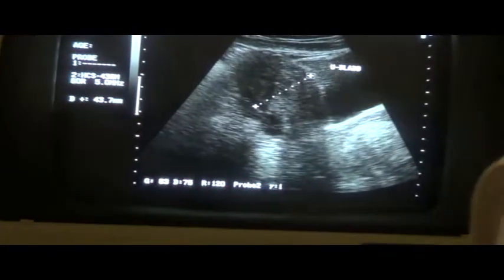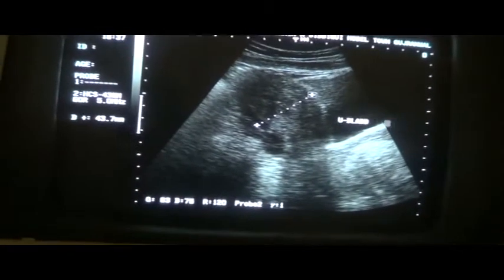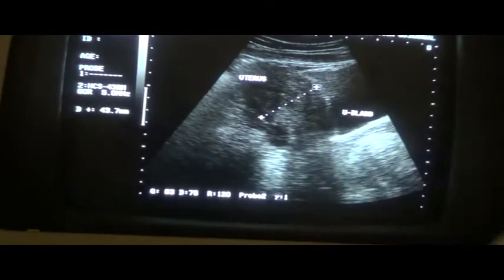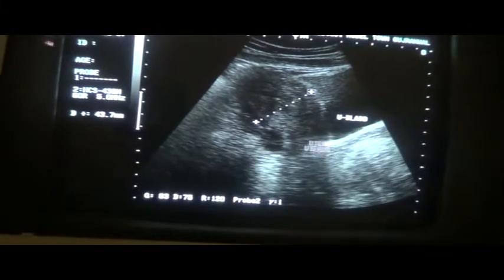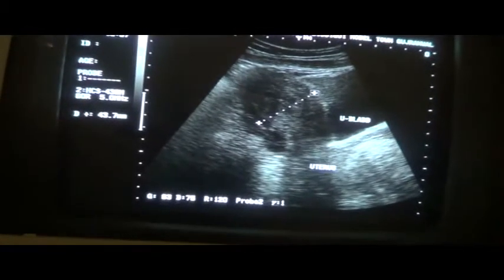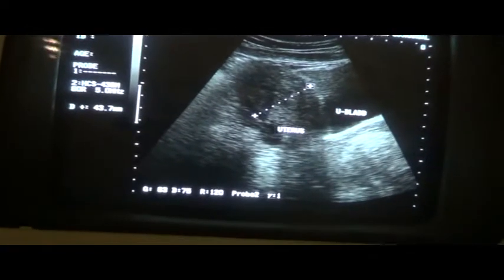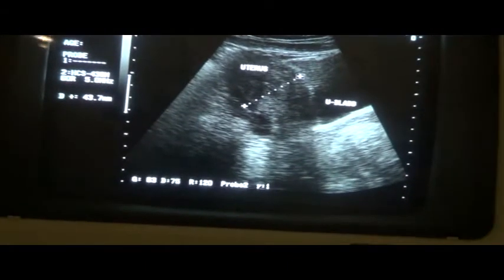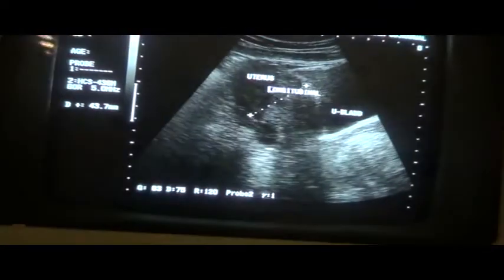This is the urinary bladder. This is the anterior segment of the uterus, posterior segment of the uterus. This is the cervix. This is the vagina. This is the uterus — the myometrium, anterior wall, and posterior wall. This is the longitudinal section.